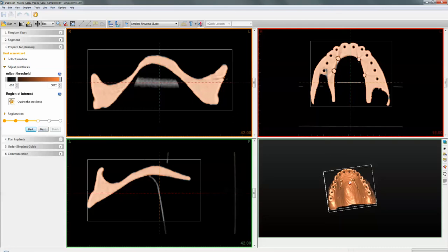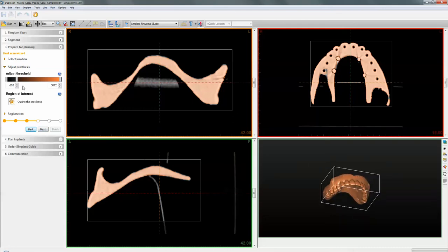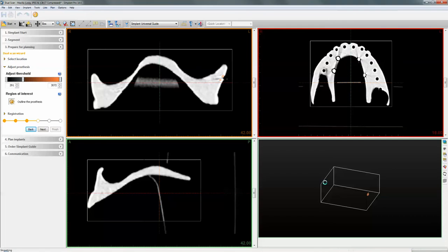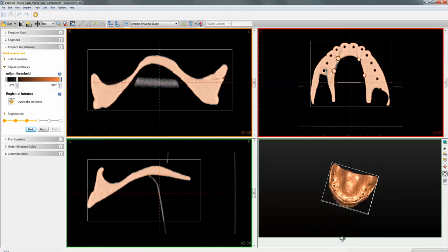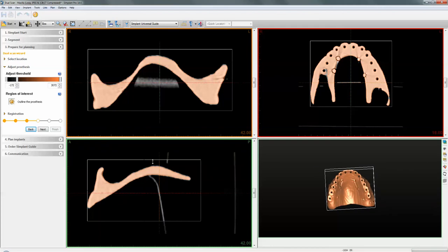If you're happy with the threshold, continue to Next. But if you've scanned at a low dosage and the image appears half visible in the 3D view, drag the threshold until you've restored that information. The reason it restores is because there's nothing else around the denture — it is black — so the software picks up whatever is in that surface area. Remember, this is a radiolucent denture, but it acts like a radiopaque denture within the implant software.